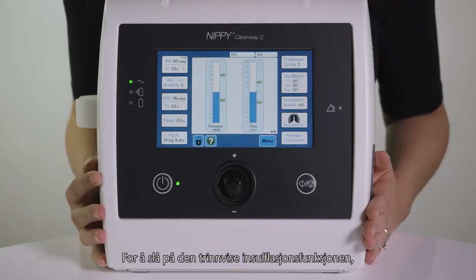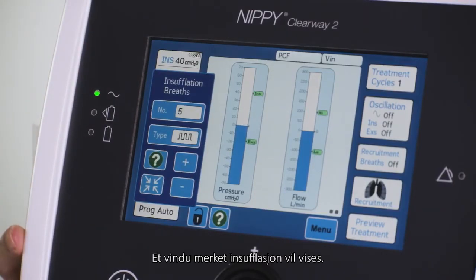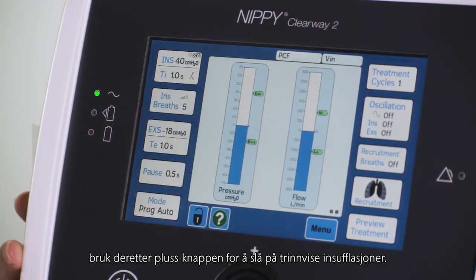To switch on the stepped insufflation feature, press the ins breaths button on the screen. A window labeled insufflation breaths will appear. Press the type button in the window, then use the plus button to switch on stepped insufflations.